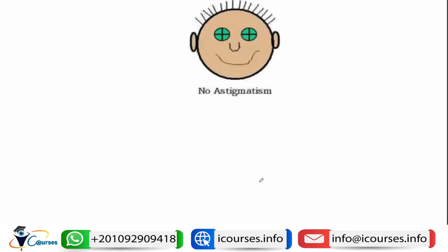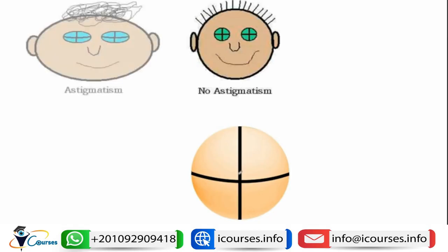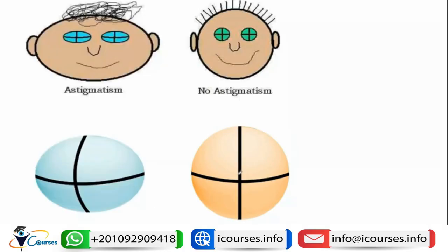Just to remind you of what we said earlier about astigmatism, if the principal meridians of the eye are all of the same power, then there will be no astigmatism, because they will be of the same length. If we have one meridian, the greatest power meridian, that is more curved, like this one, it will have a smaller radius of curvature.